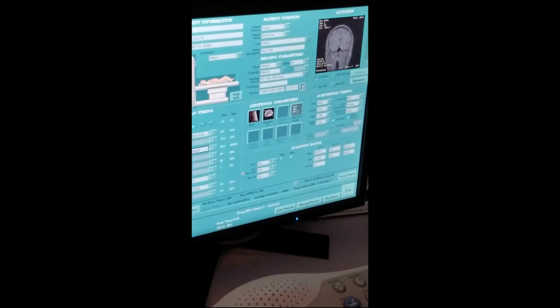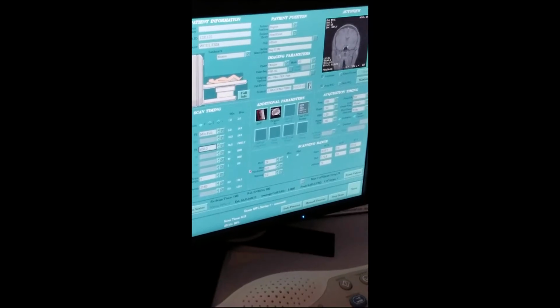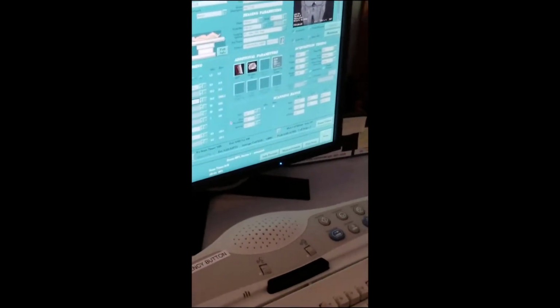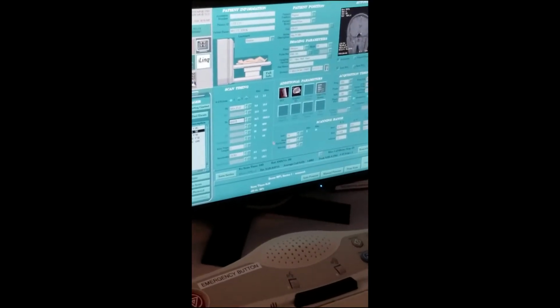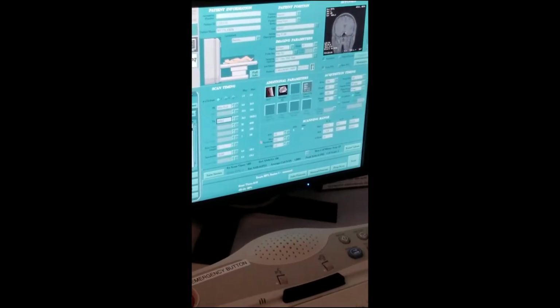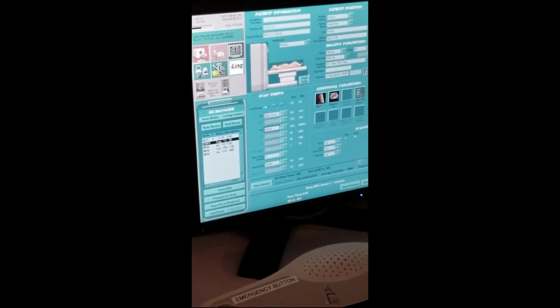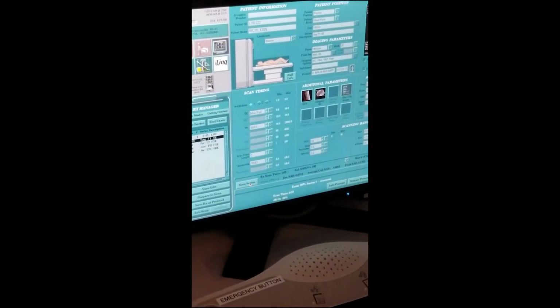But for right now, we want short TR and we needed 23. We got 23 with 650. So hallelujah, that's great. We're good. So what do you do? Save. We're done, because everything else is populated right now.